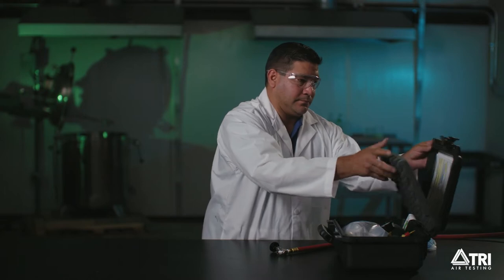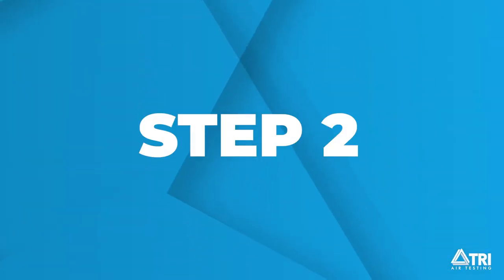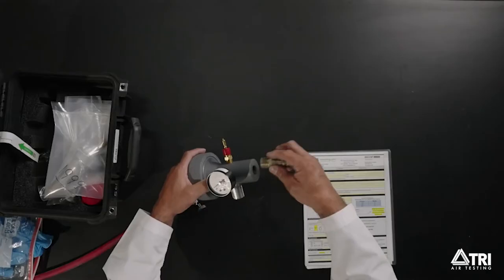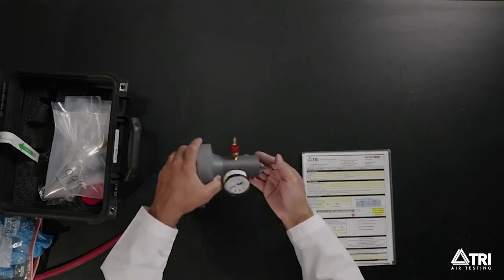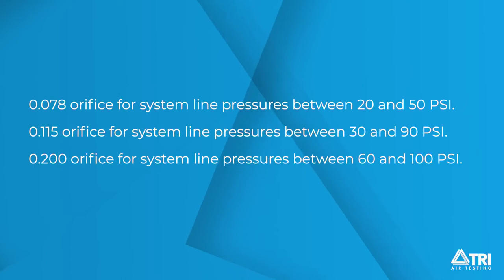While the compressor is running, remove the data sheet from the kit behind the foam lid. Step 2. Find the orifice plate by unscrewing the noise muffler. The size is etched on the plate. Here are the suggested orifice sizes for your compressor's output PSI.